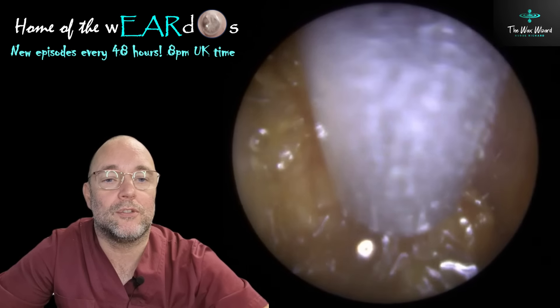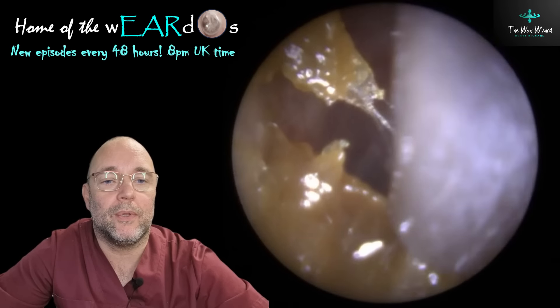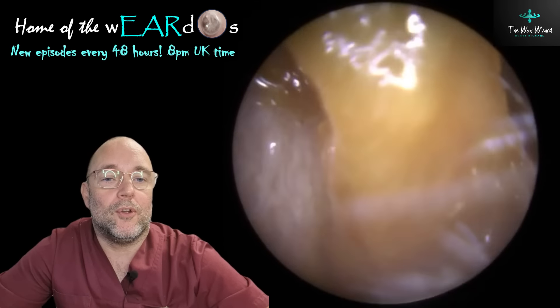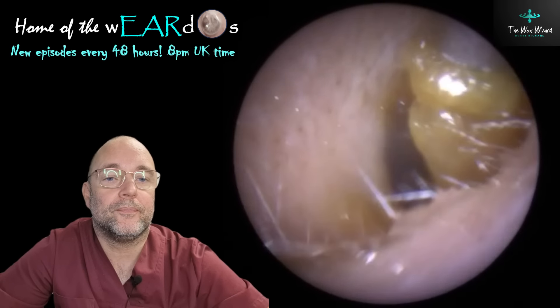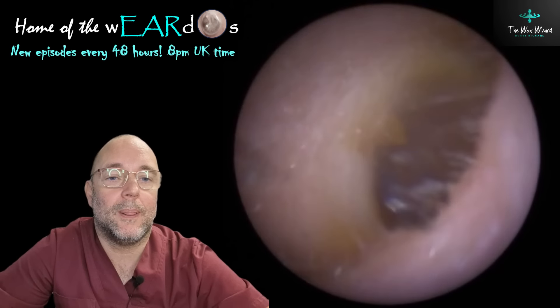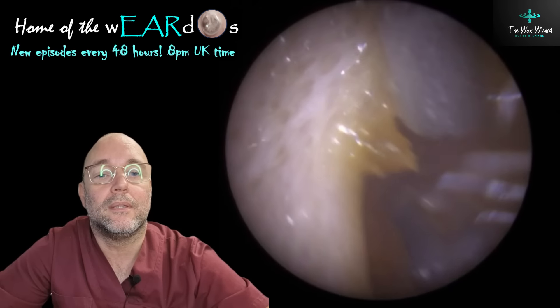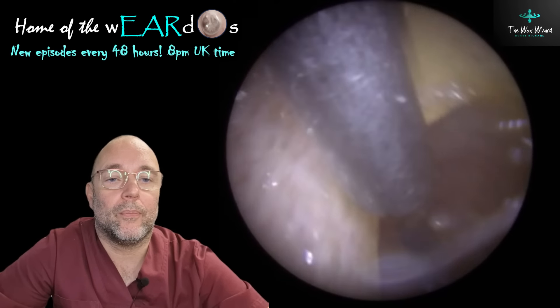Last one here, just a quick little slurpy one. Fell in to see me with a half-blocked ear, so I threw a load of oil at it because it was kind of this sludgy stuff. Threw a load of oil in there and it just slurped up nicely. I know some of you like a nice slurpy, slimy one. There we go. Just get that little bit while I'm already here. There that one is.